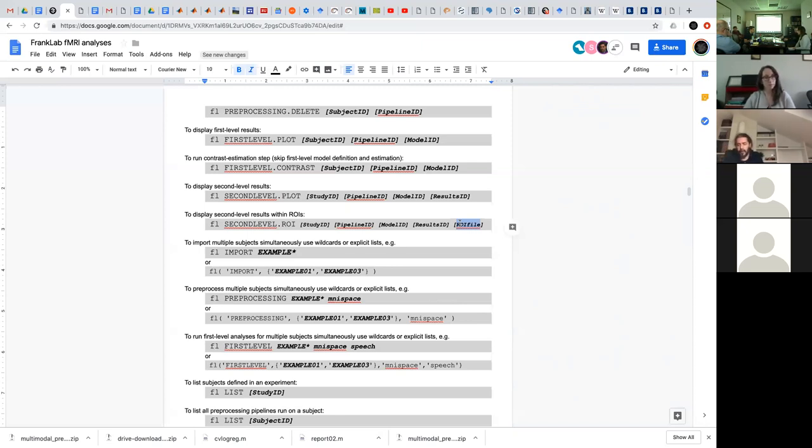In the current implementation, you can also specify a 4D volume. So you can still have a single Nifti file that contains a four-dimensional volume, like all of the time series data. You can also have multiple 3D volumes within a single Nifti file. That would be a way to have, in a single file, multiple ROI definitions that allow overlapping for a particular voxel. So a voxel can belong to two different ROIs, which cannot happen with the other approach, where you specify the ROI by an index number.